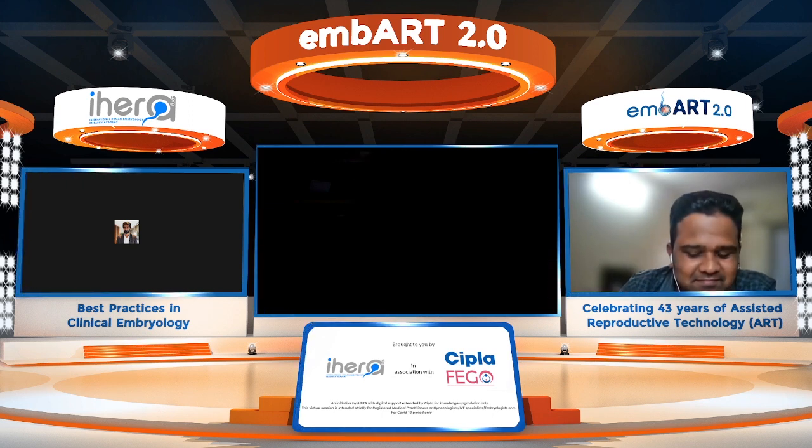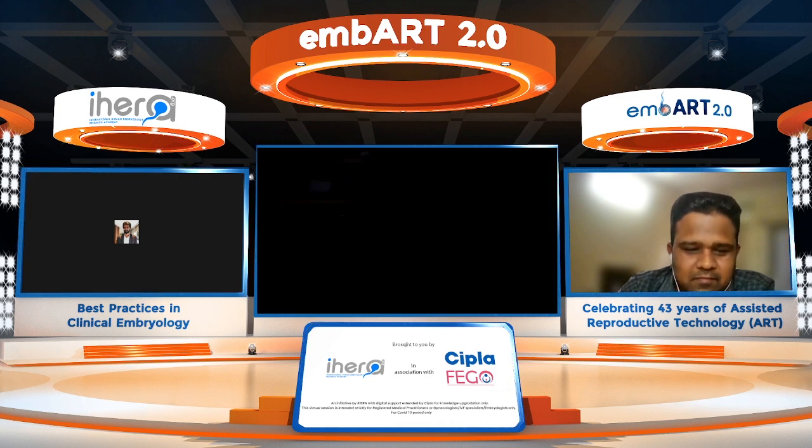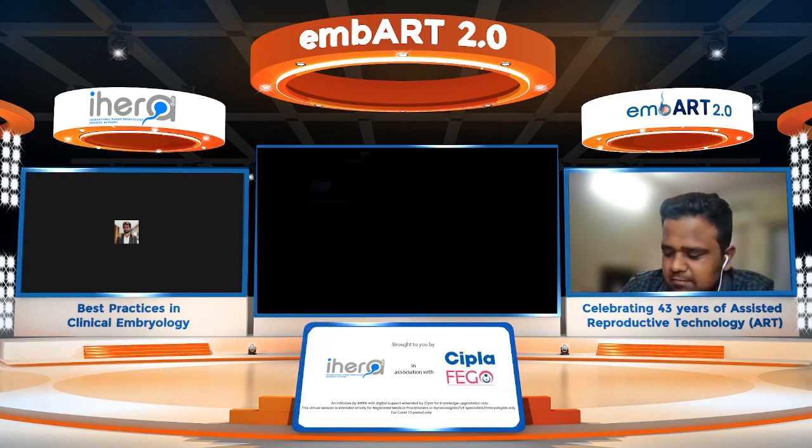And with Rahul's point, he was more on centrifugation. I know we do quite a bit of centrifugation on density gradient, but there is a controlled centrifugation rate where we don't give too much damage to your sperms. On the conventional side, there's one more highlight: we can do a double selective method where you do a density gradient, then from that pellet you do a swim-up and take that yield. Sperm yield might be less, but you can still go ahead with your IVF, and it's more or less a functional sperm.